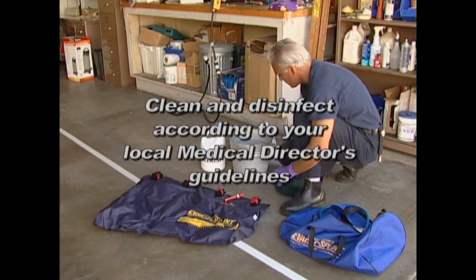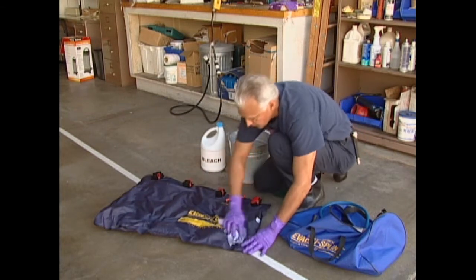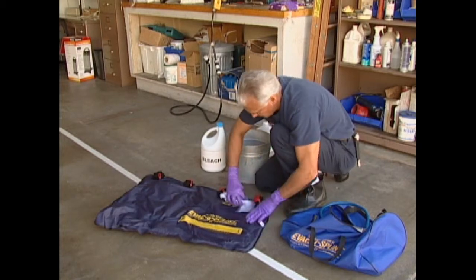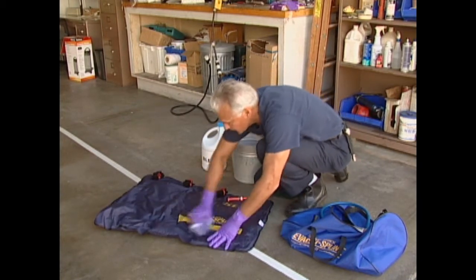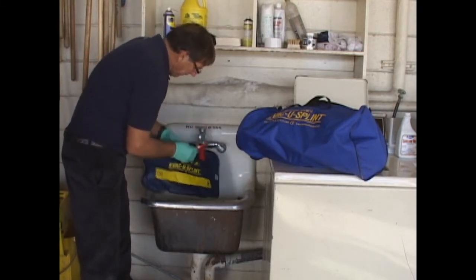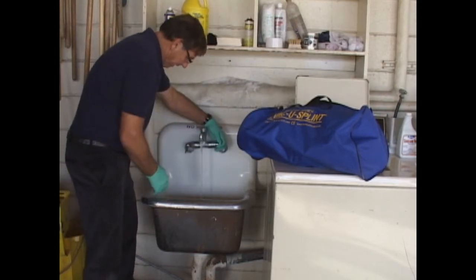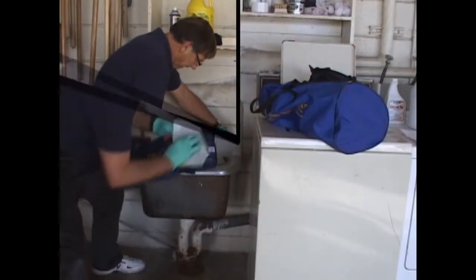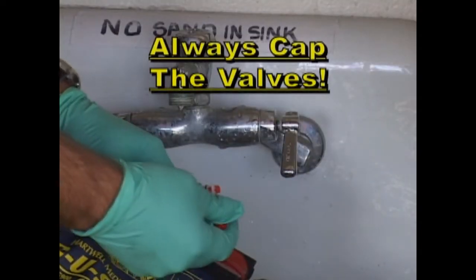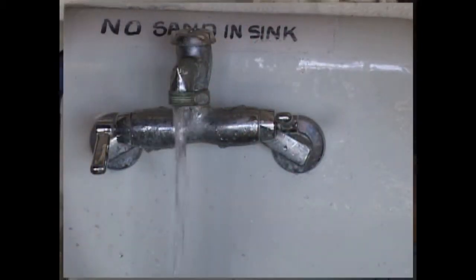Clean and disinfect the EVAC-U-SPLINT according to your medical director's guidelines. The EVAC-U-SPLINT and the splint straps should be cleaned using soap and water, or a mild detergent, or a commercial cleaner disinfectant. When the splint has been exposed to blood or body fluids, it should be cleaned using cold water and then allowed to soak in a detergent solution for 24 hours and then thoroughly rinsed and dried. Always keep the red leash cap on the maxi valve when soaking the EVAC-U-SPLINT.